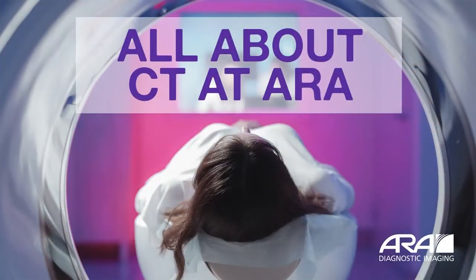I want to start with the first question. Through TV and friends and even personal experiences, perhaps, we've all heard about CT scans or CAT scans, but what is it exactly? Can you help explain that to our friends at home?